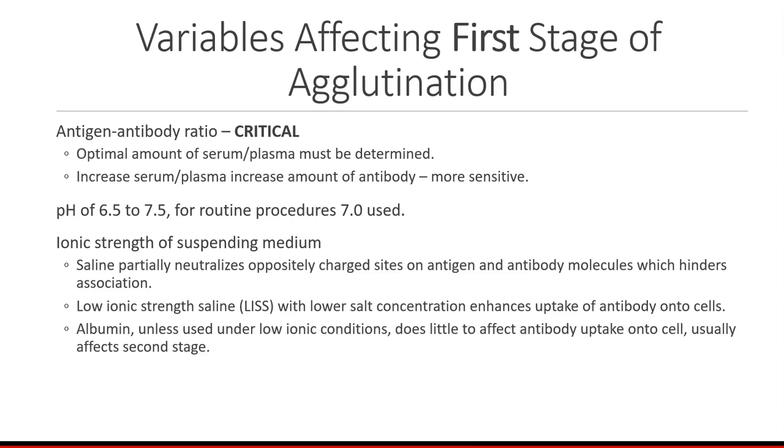Albumin is a reagent that used to be routinely used, not so much anymore. It does little to affect antibody uptake onto the cell. It usually affects the second stage. It reduces the electrical charges so the antigens and antibodies can come in closer proximity.